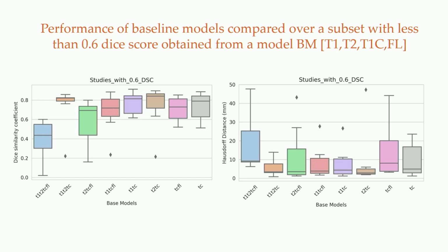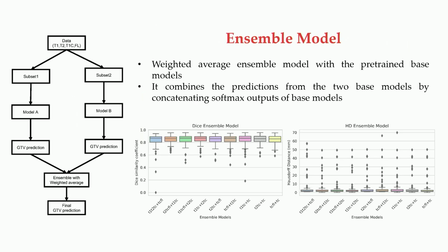The image shows the first one is the model trained with all 4 inputs. The last one is with only the post-contrast image. You can see here how the segmentation accuracies vary with the model inputs, and this is also supported by the Hausdorff. So we learned that to have accurate segmentation, by combining the individual models we trained, we can preserve the modality-specific information we fed to the model training, which may increase the segmentation accuracy.